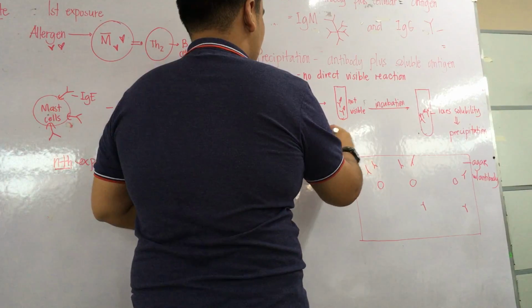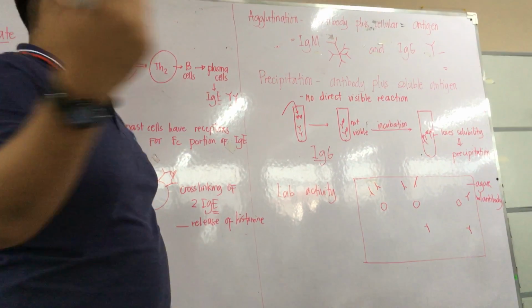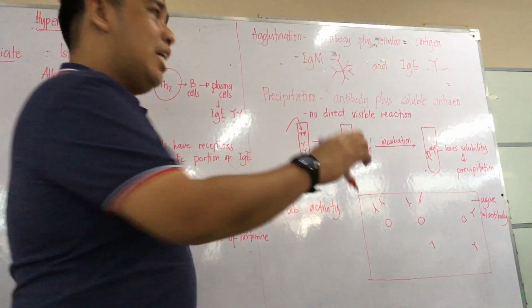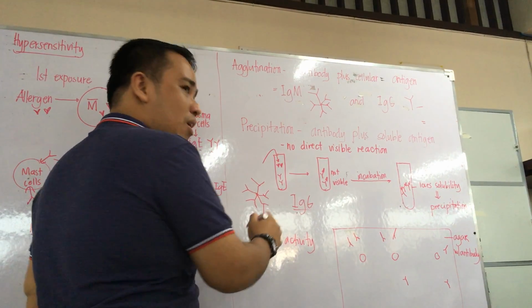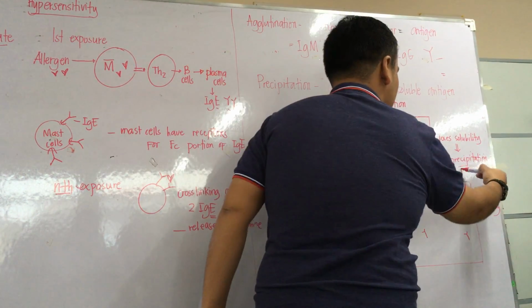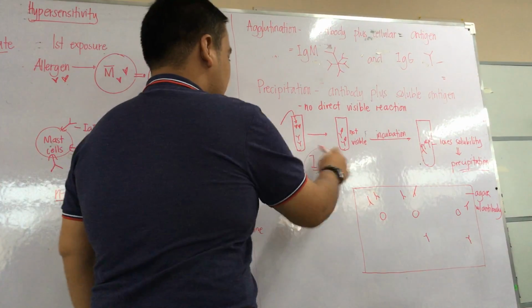So if you will be asked during the moving exam or in the lecture, precipitation tests are designed to measure the answer, IgG. Kasi kung IgM yan siya, it would forfeit the purpose. Kasi kung IgM na pentameric, automatic mag-precipitate out ang kumbaga. Kasi bakit man, you allow them to cross-link before they will precipitate. So the best antibody for this one is actually IgG.